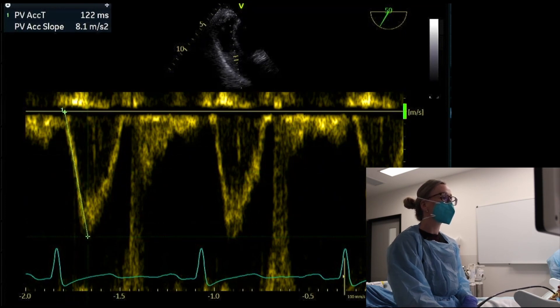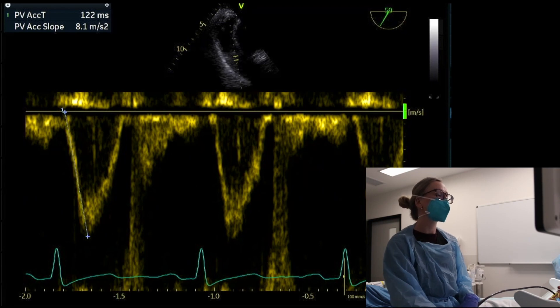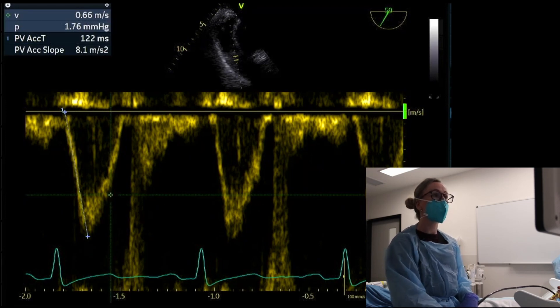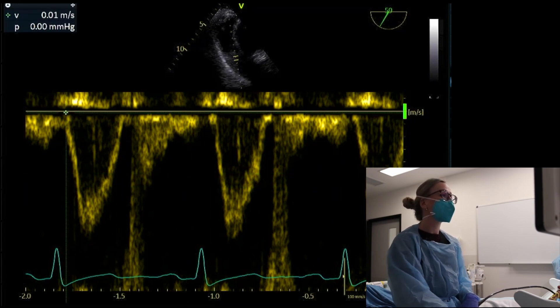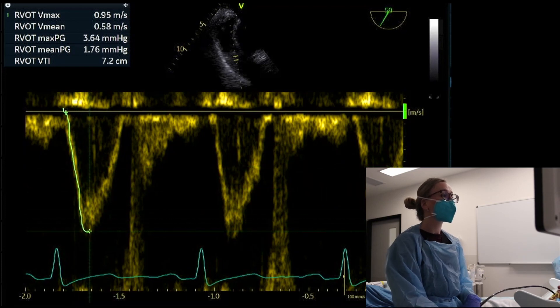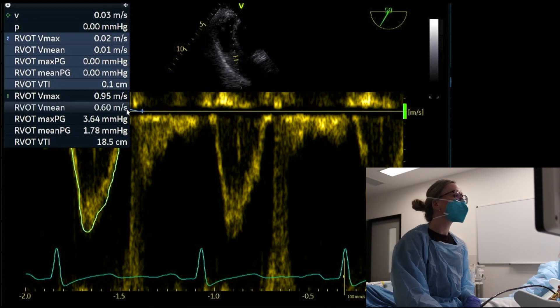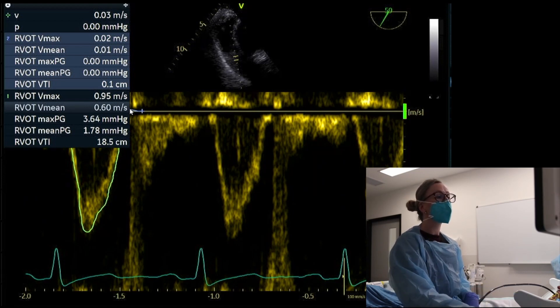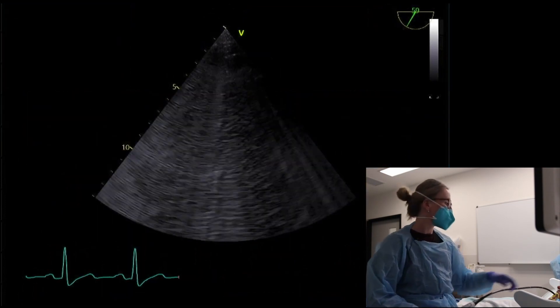Acceleration time less than 105 milliseconds is indicative of raised pulmonary vascular resistance and raised pulmonary pressures. Less than 90 milliseconds has reasonable performance in detecting significantly high pulmonary vascular resistance of more than 3 Wood units. We can also trace the RVOT to calculate RVOT VTI — useful when we can't get a good LVOT trace — and combine it with the RVOT diameter to get stroke volume and cardiac output. Here we get 18.5 centimeters. We should also look for notching in the waveform shape, putting it all together with the whole clinical picture.